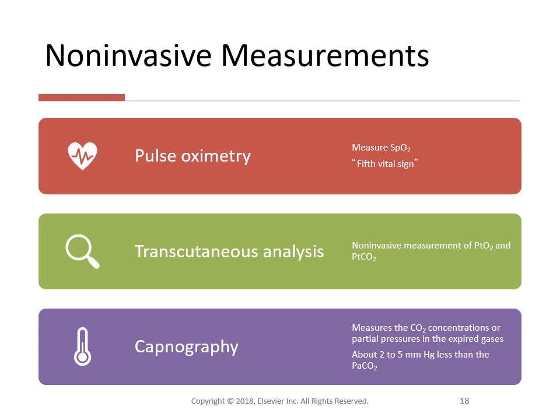Pulse oximeters use the spectrophotometric principle of light absorption. The standard device probe transmits two wavelengths of light, red and infrared, through capillary beds such as an earlobe or a finger. A fairly constant level of light is absorbed by tissues in venous blood.